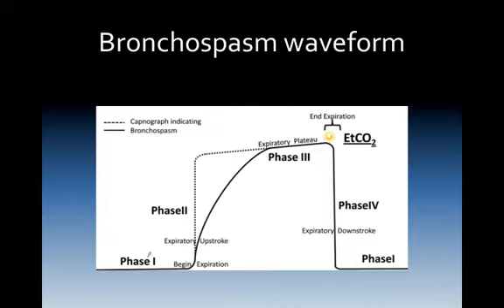Our normal phases, phase 1, phase 2, phase 3, this is supposed to be our alveolar plateau. But what we see here is a slow shark fin kind of coming up. What that says is that I'm having a hard time getting ventilation out, and it's slowly increasing. Uneven emptying of the alveolar gases alters the emptying on exhalation. This produces changes in the ascending phase, or phase 2, with a loss of the sharp upslope, and it alters the alveolar plateau, producing a shark fin.